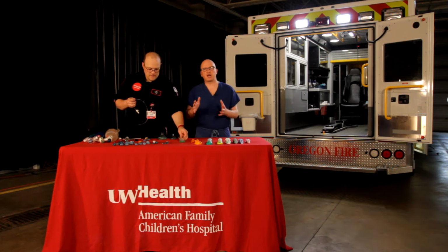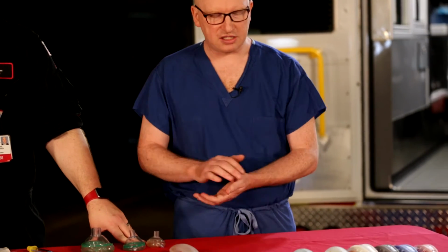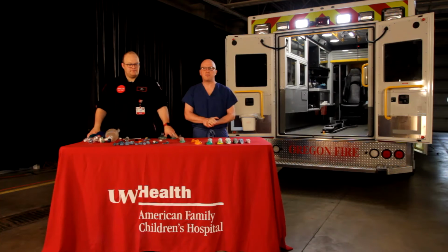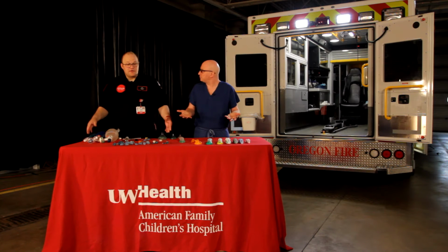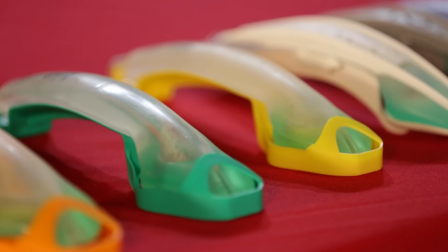Now, before we go and talk about exactly how we know that these devices are in the right place, let's talk just quickly about sizing. Yep. And something that I had actually thought until today is that the colors on these devices would correspond to the Broselow tape size of these patients. But it turns out that's completely wrong. It's a good idea. Unfortunately, it wasn't one that was had by the people that invented these at that point. So the colors are actually different.